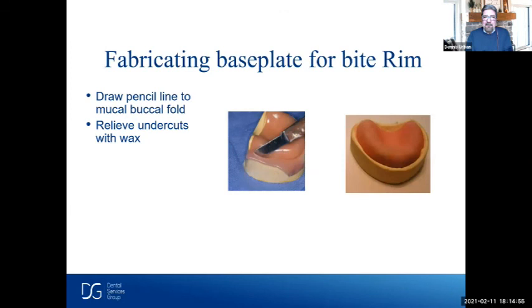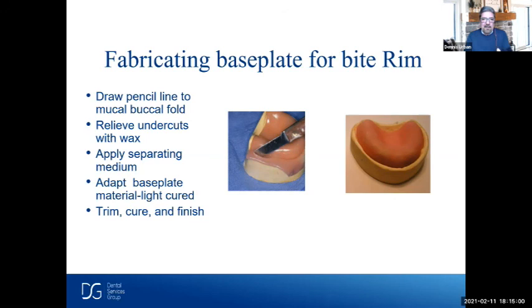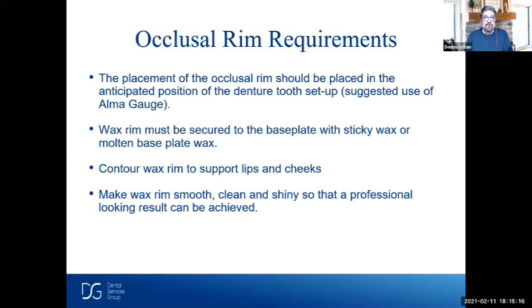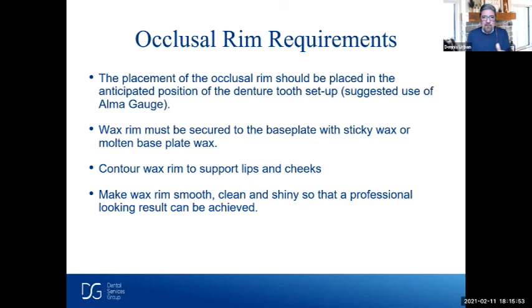To fabricate the base plate for the wax rim, I draw a line at the mucobuccal fold, relieve any undercuts, apply separating medium, apply the base plate material, then trim, cure, and finish. We want a good stable base plate that's smooth and retentive so it stays in the mouth during try-in. The placement of the occlusal rim should be in the anticipated position of the denture tooth setup — about 8 to 10 millimeters from the papilla on average, which is where you're setting denture teeth. The wax rim must be secured to the base plate so it doesn't tear away.